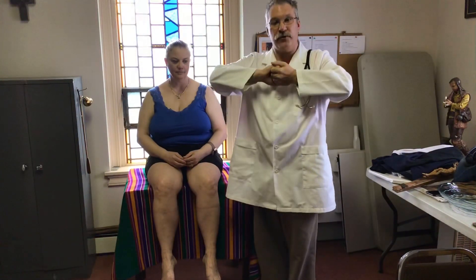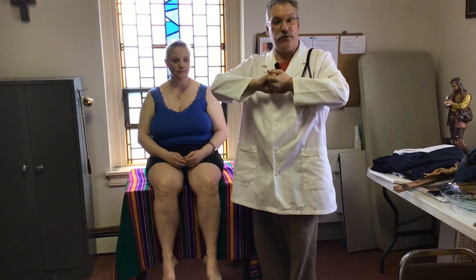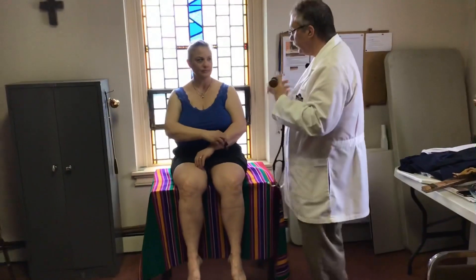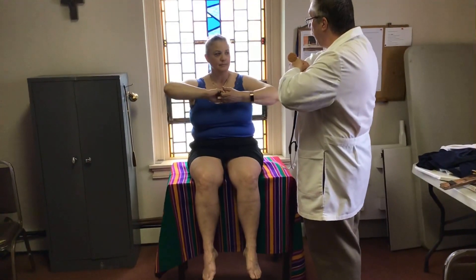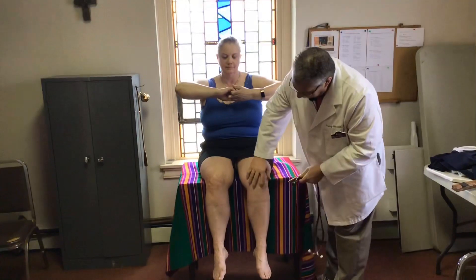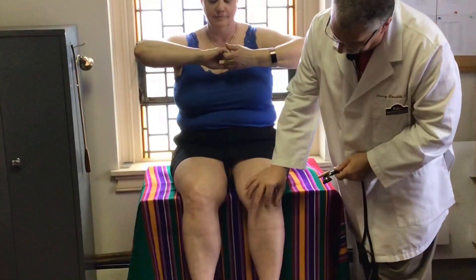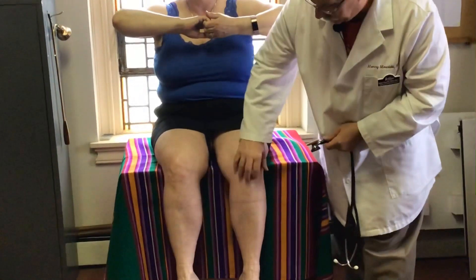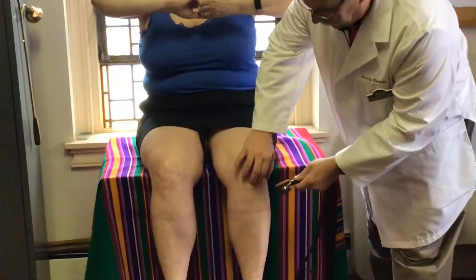Next we'll progress to the lower extremities and do the patellar reflex. For this, you want some reinforcement for distraction — that's on your CPE. Have the patient hold their hands like this, and tell them to count to three and pull. That distraction will give you a better response. The patellar tendon is huge — it goes from here to here. Feel for the spongy part and her leg will kick.